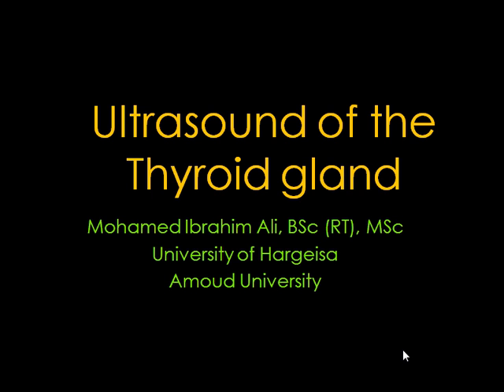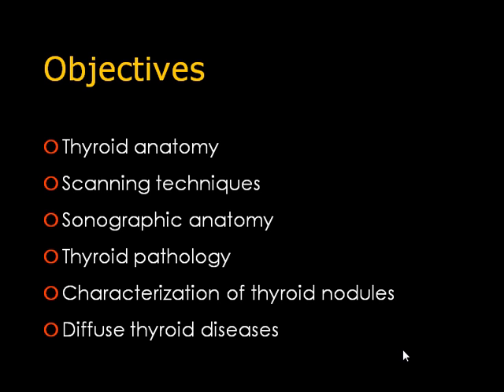In this presentation we are talking about the thyroid ultrasound. We will discuss anatomy of the thyroid gland, scanning techniques, nodular thyroid disease, sonographic features of benign and malignant lesions, and diffuse thyroid disease.